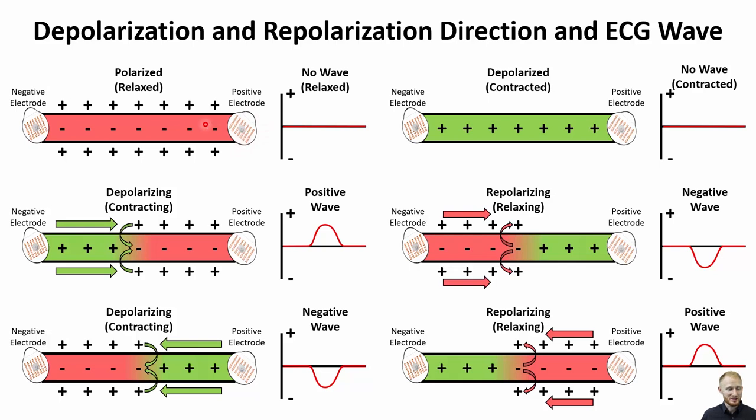And just like with ECG, one of those electrodes is negative, one of those electrodes is positive, and we just assign it that. There's nothing different about them. They're the same type of electrode. We just, using our computer within the electrocardiogram system, it's going to say this is positive, this is negative. It just chooses, and there's a way we do it in a standardized way, but it's something we'll get to later on. Again, on each side of the cell, we have electrodes, negative and positive.